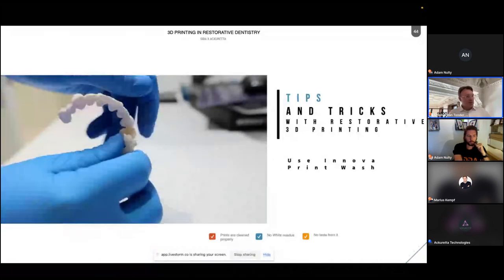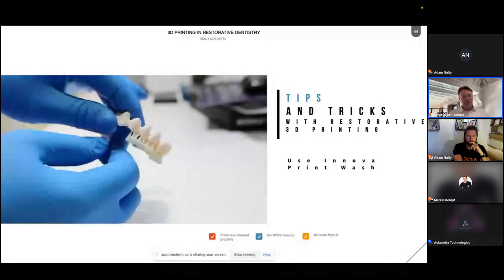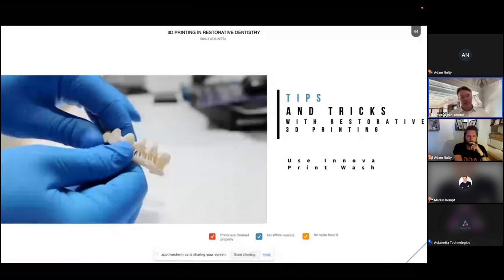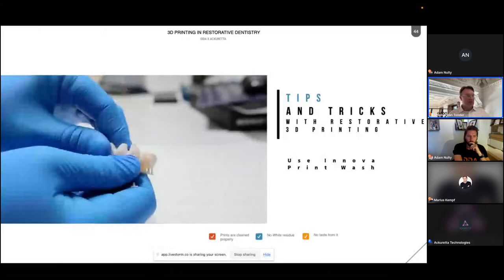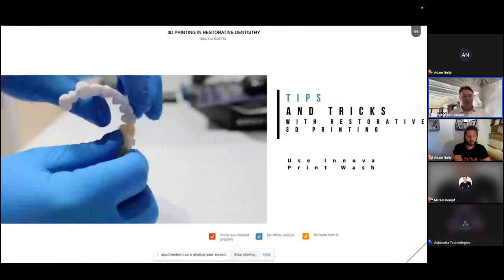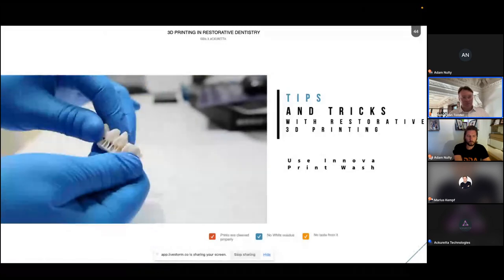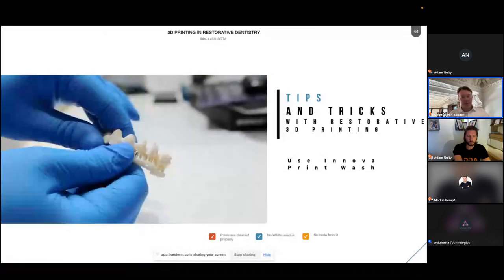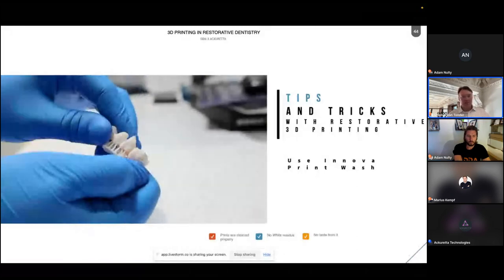Yeah, I think that's on one of the next slides. But what I wanted to show on this one is specifically, if you look at that one, that's been washed in just IPA. And look how white that residue is on there. It's nearly impossible to get that off. So it's important that you wash it in this.